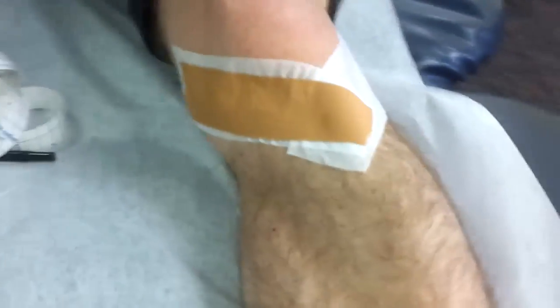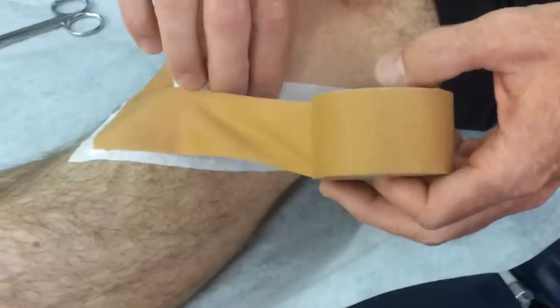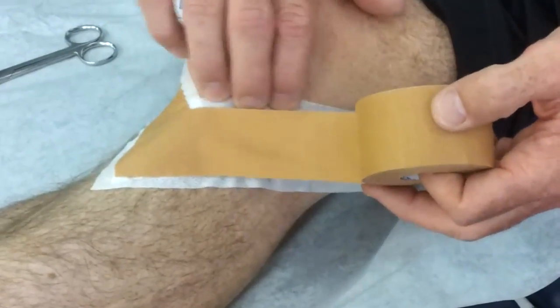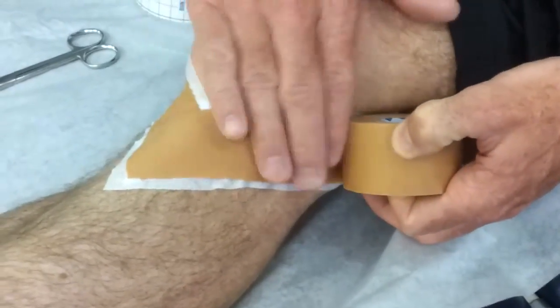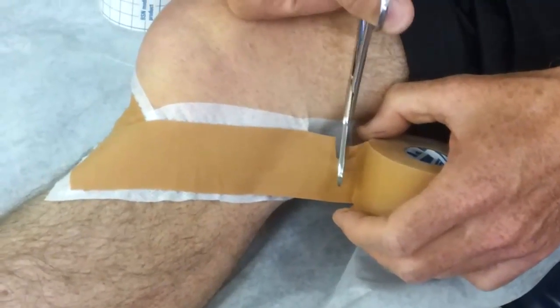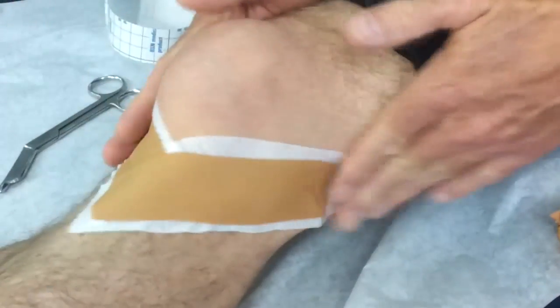The creases would be more noticeable if you actually had a swollen or irritated fat pad. On the other side, stick it down at the X, and again use your fingers to pull up and toward the X — parallel to the tape — to create some slack in the white tape. Then lay down the brown tape with minimal tension. If you can't rip the tape with your hands, you can cut it with scissors.